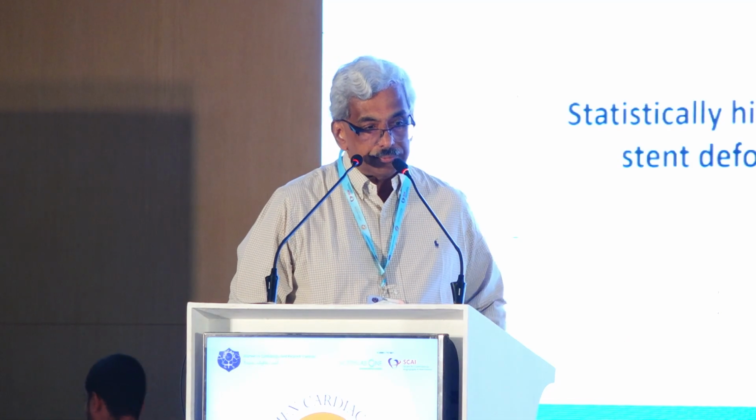The question is that you were lucky that you had a 3.5 circ, a 3.0 LAD, and a 4.7 left main. Say you had a 6 left main, what would you do? That's where the issue starts, when you have a lesion which has such a mismatch. And that is where things will change, and that is where you need better stents for the whole thing.